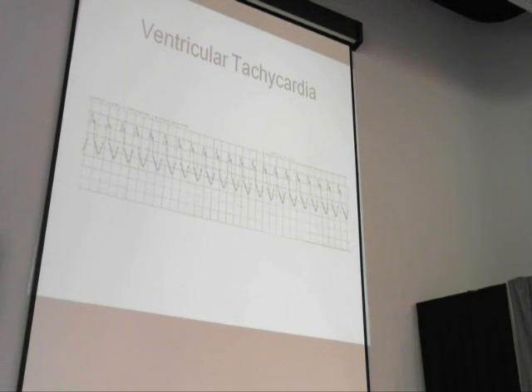Stable with ACLS, we're going to talk about tachycardia, stable and unstable, and look at tachycardia, VTAC, and those things. Now, can a patient be stable with VTAC? Maybe. ACLS things have changed. As I told you about the precordial thump I did a long time ago, that used to be the recommended thing. If you saw somebody in VTAC, we did that.